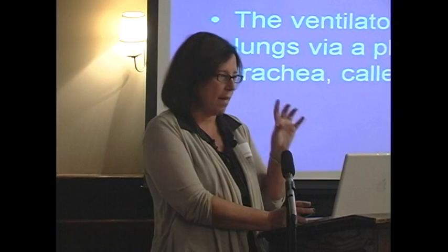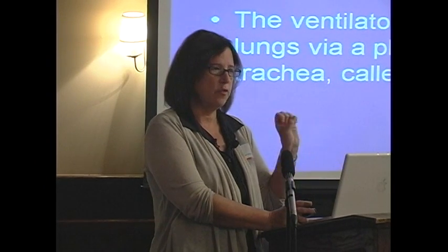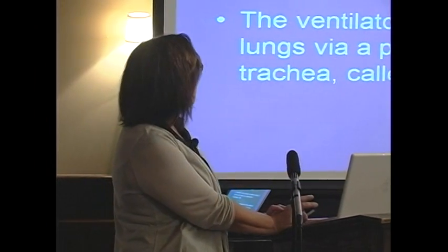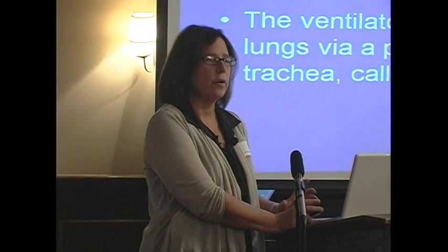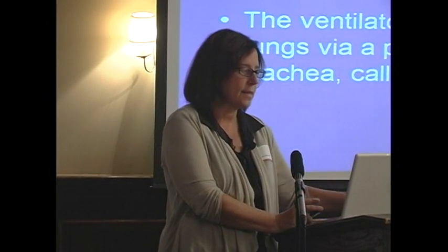It delivers an amount of air. It delivers a certain number of breaths a minute, and it is considered complete life support. So with a ventilator, it is considered invasive. A person who's on a ventilator has a tracheostomy. It's not delivered through this type of a mask.